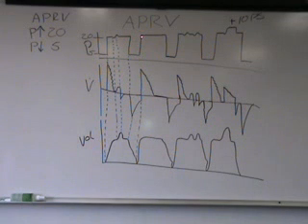We re-establish P high before the person exhales all the gas that was given into their lungs from the previous breath. Therefore, if I look at my volume scalar, you see that my volume scalar resets to 0 because the next breath begins. So that volume never actually made it all the way back out of the patient's lungs. The flow rate never decelerated all the way back to baseline. And this is why a person generally will not breathe at the P low level, because you simply don't give them enough time. They can breathe at the P low level, but they usually won't if you set it up in this inverse ratio.